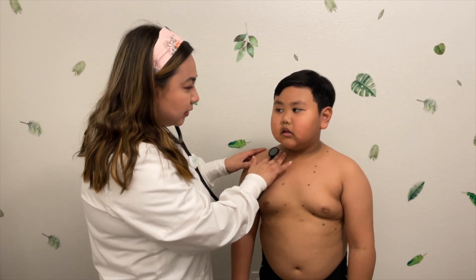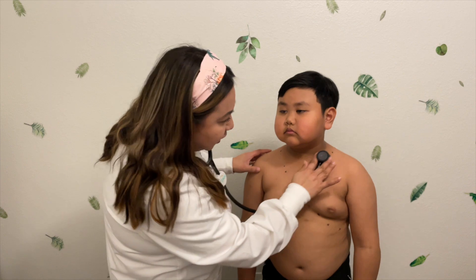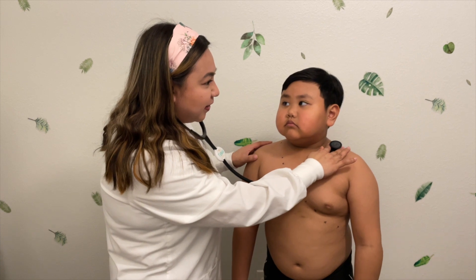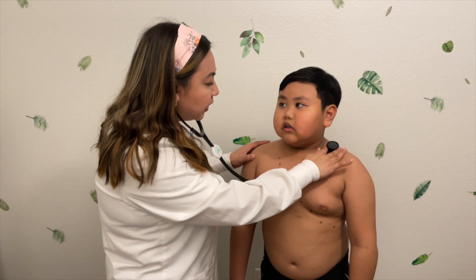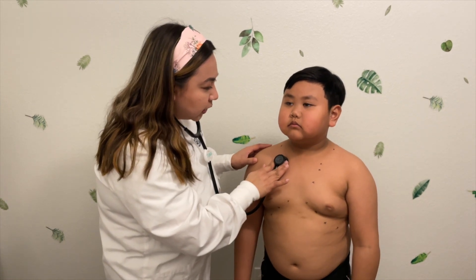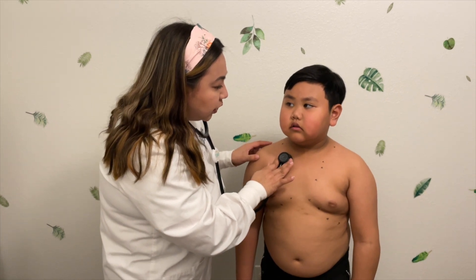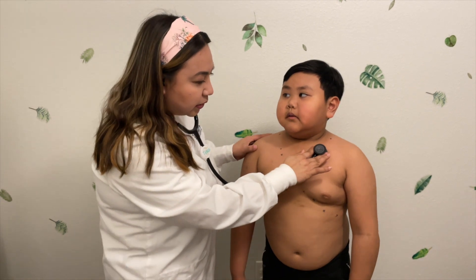As your mom, it's very important for me to hear clear sounds. Good — just breathe thoroughly. I'm moving over to the next position, and I'm using the diaphragm side of my stethoscope.